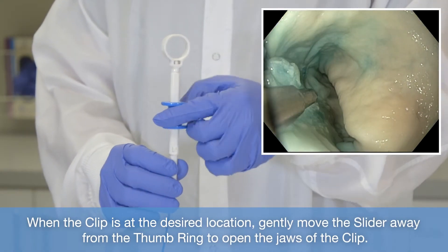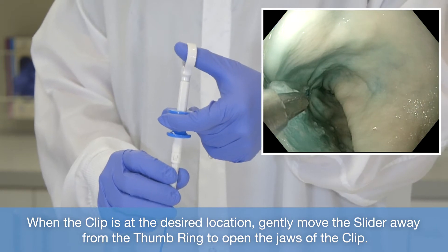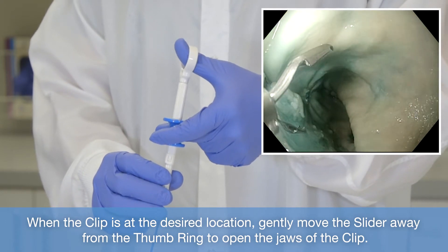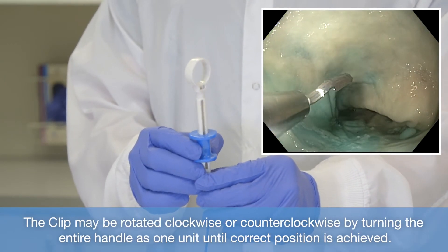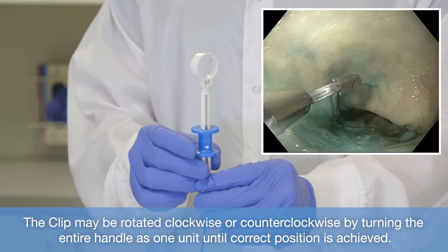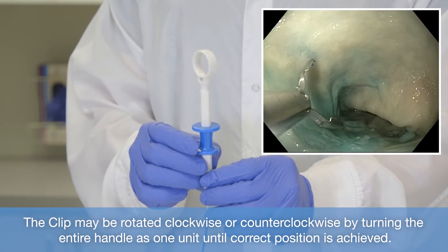When the clip is at the desired location, gently move the slider away from the thumb ring to open the jaws of the clip. The clip may be rotated clockwise or counterclockwise by turning the entire handle as one unit until the correct position is achieved.